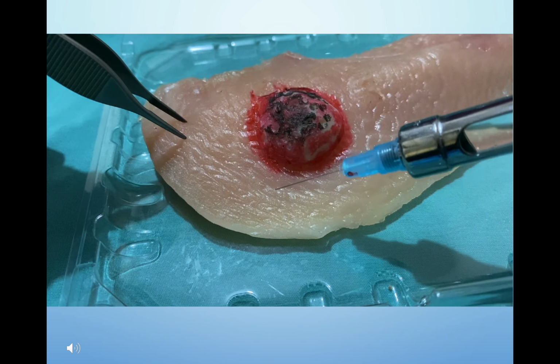Now the specimen is ready to be placed into the specimen bottle, which contains formalin solution with a volume of 15 to 20 times the specimen size. You must avoid placing the specimen on dry gauze.